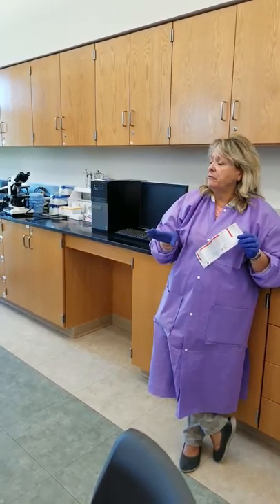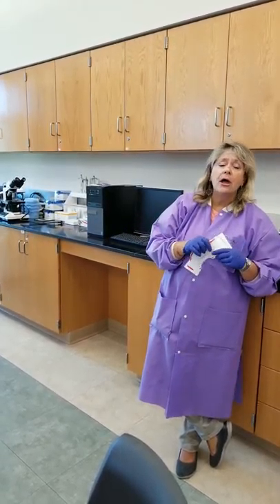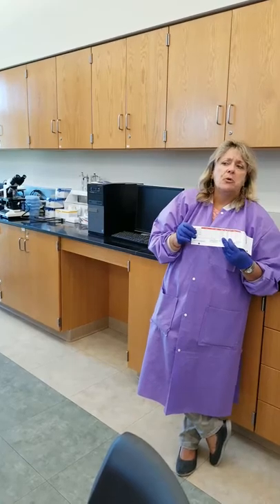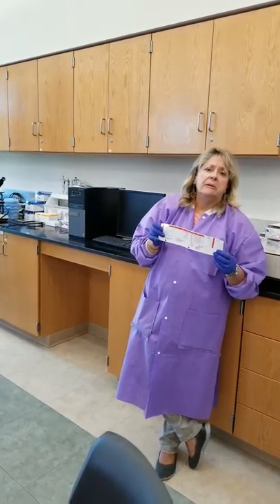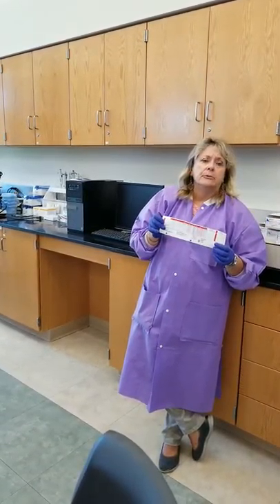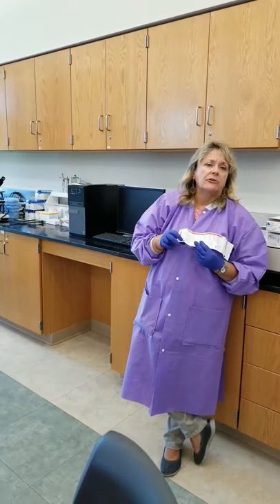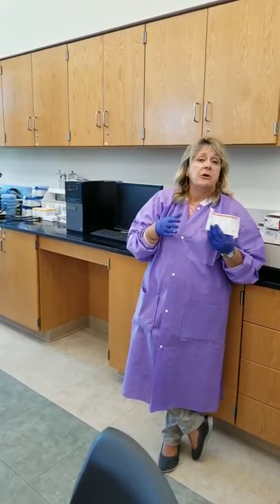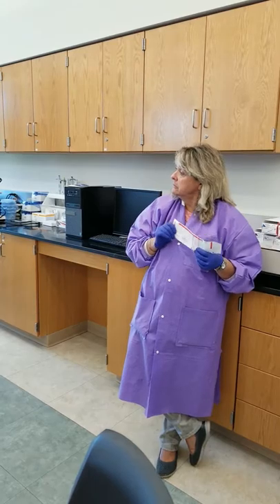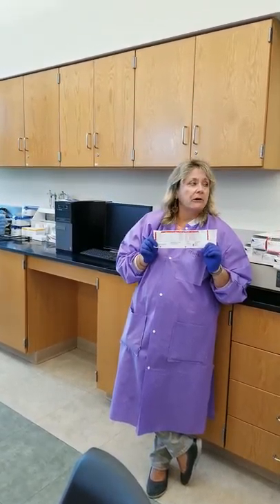The other thing is, remember, these come from people. These are not artificially made. So this was a donor once upon a time, and so they're going to have different setups. You know, number 1 may be homozygous for big K, and number 3 may be homozygous for, say, big S, whereas the next lot number, that may not necessarily be true. So even though 1, 2, and 3 are always R1R1, R2R2, and little r, the other antigens vary, and you need to make sure that you have the right lot number. This has messed up more than one budding blood banker in their quest to find an antibody because they have the wrong antigram to go with the cells that they're working with. So you need to make sure that that's happening.